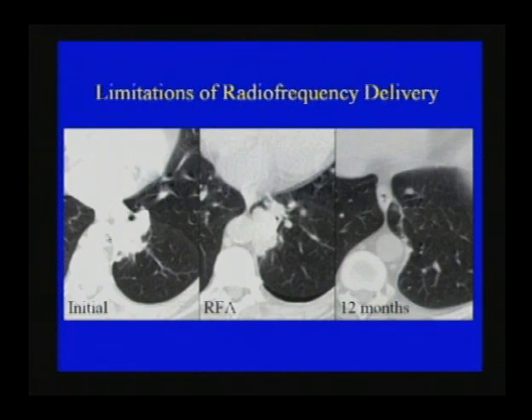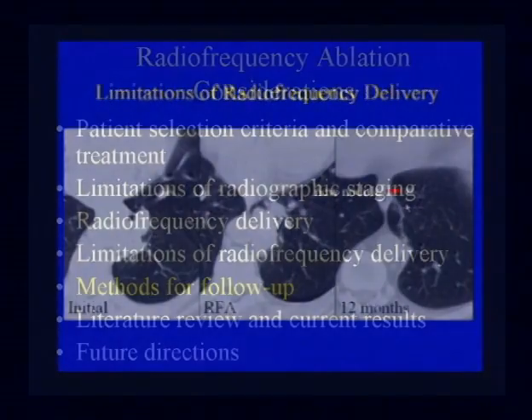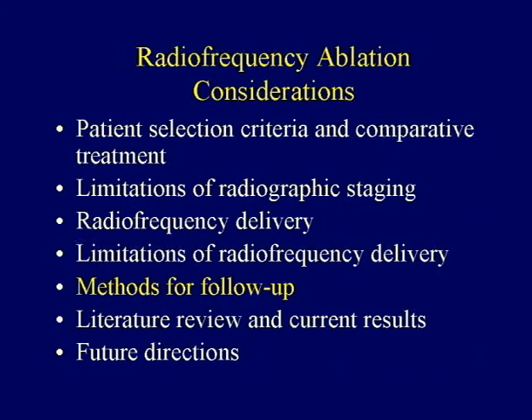It was situated, again, next to two very big vessels. You obviously want to place your needle carefully, but more concern is the heat sink effect from the adjacent blood structures. Good deployment of the needle was achieved, and we thought we'd done a really good job with the burn when a new nodule cropped up just in the adjacent section. And so this is part of the issue as to how we decide when and how to do these procedures.